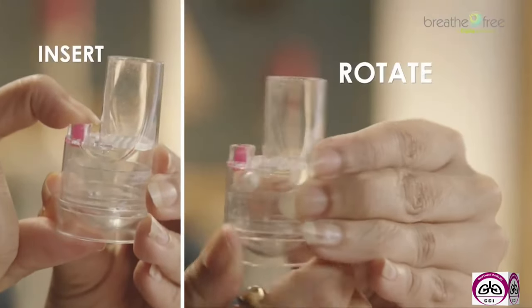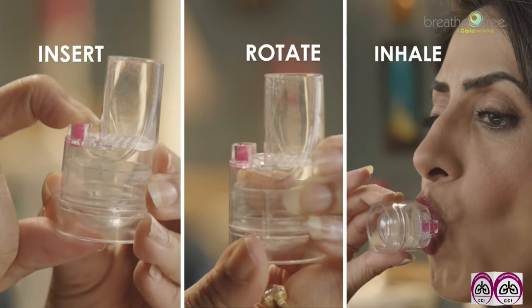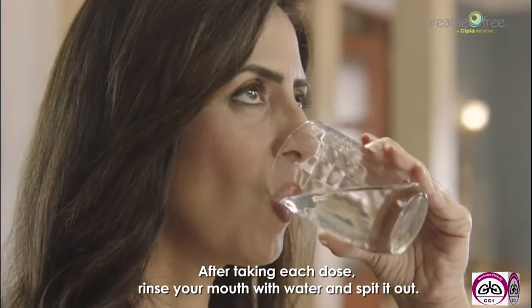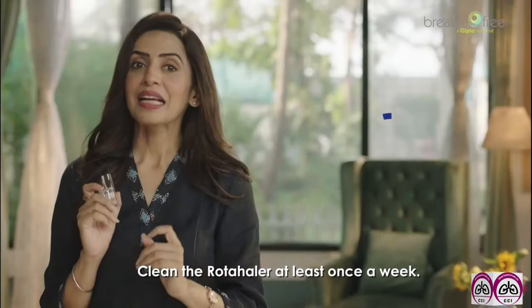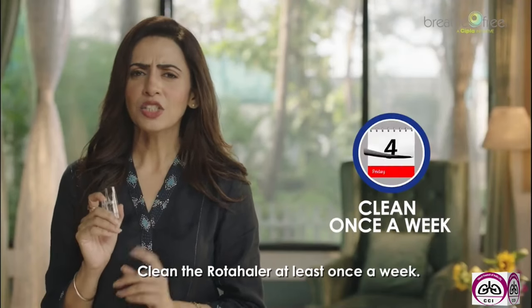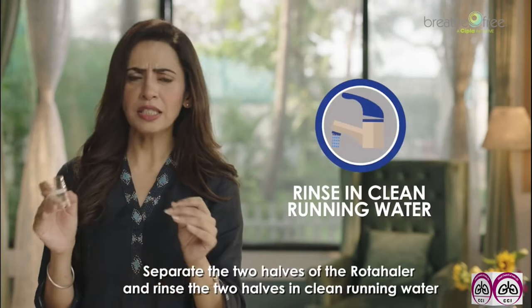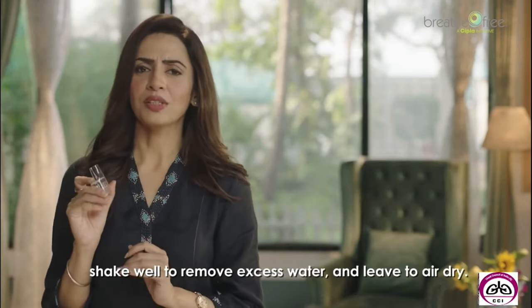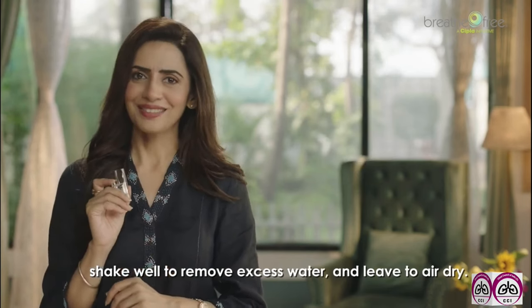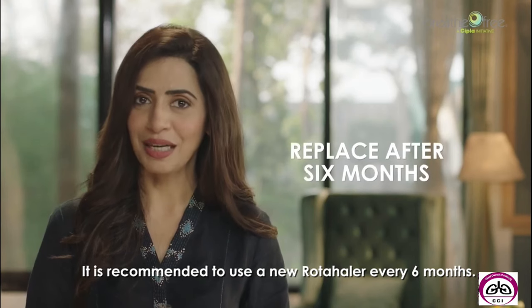Insert, rotate, and inhale. Important instructions. After taking each dose, rinse your mouth with water and spit it out. Clean the Rotahaler at least once a week. Separate the two halves of the Rotahaler and rinse them in clean running water. Shake well to remove the excess water and leave it to air dry. It is recommended to use a new Rotahaler every 6 months.